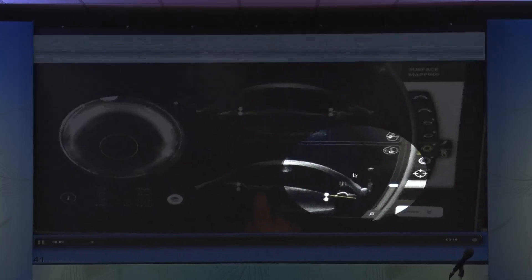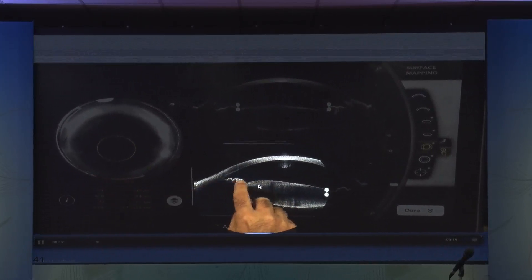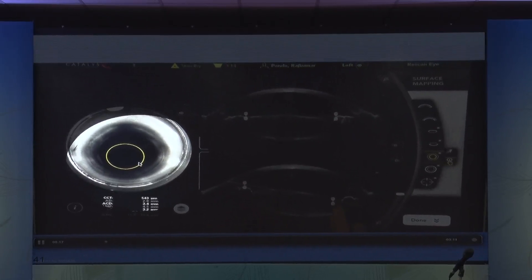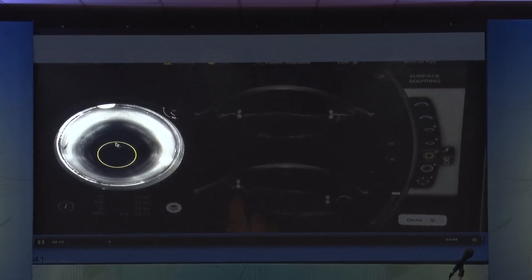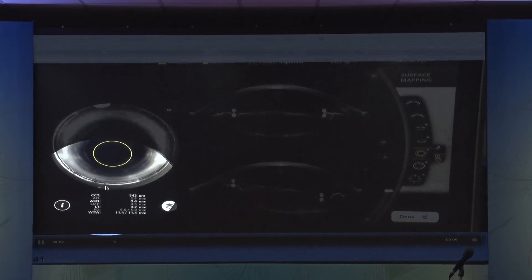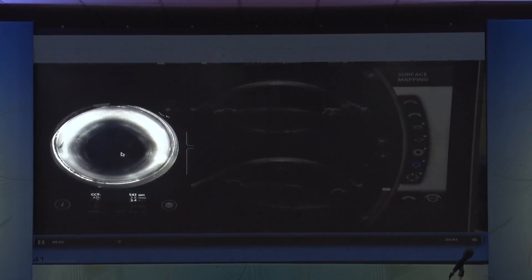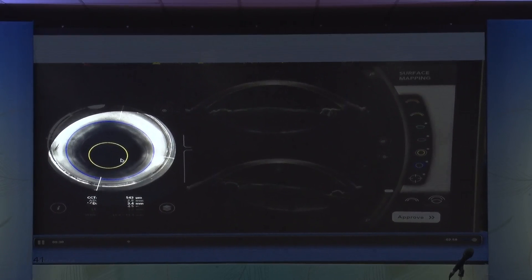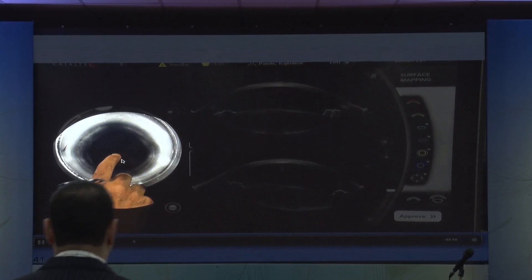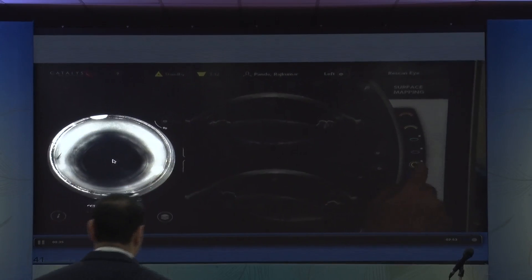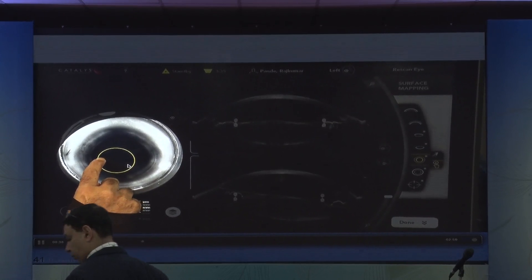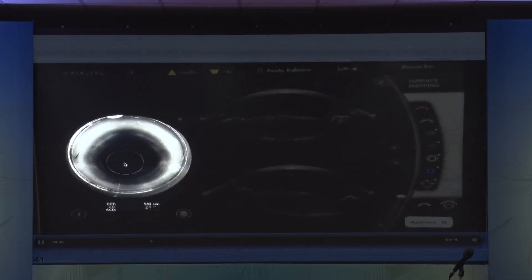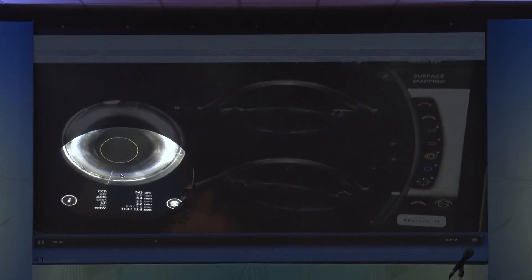You have to adjust your CCC. So what I'm doing here is adjusting the level and the size of the CCC. This is what will determine the size of the CCC. Since the subluxation is inferior, I wanted to keep the CCC away. So now I'm playing with the size of the CCC, shifting it with the finger and moving it away from the area of the subluxation towards the incision. Moving the finger in a different direction can also increase the size of the CCC.